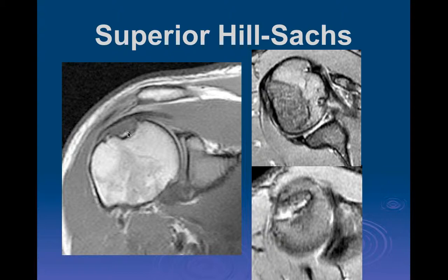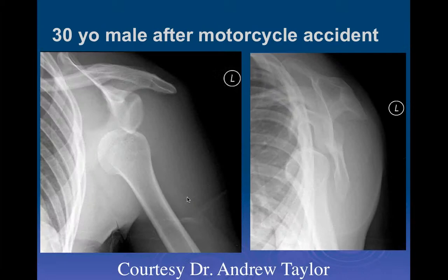And here you can actually see that the supraspinatus tendon is still coming around. Yeah. Maybe it's partially torn. There's the long head of the biceps going up, so a lot of abnormality here. And then here you can just see the empty glenoid fossa and the displaced humeral head. So that's an inferior displacement. It's one of the less common, not the least common displacement, but one of the more uncommon displacements.